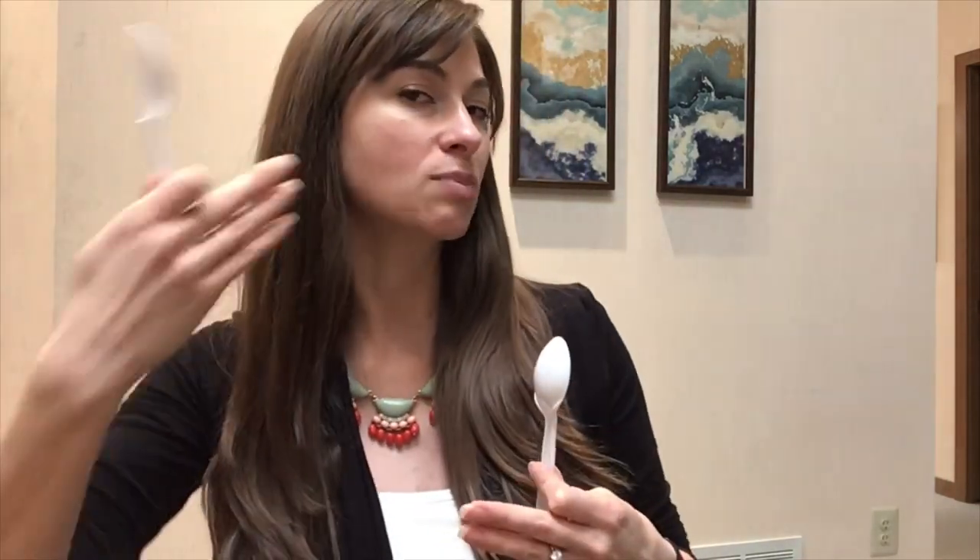Don't push your chin forward and bite on your front — bite on your back teeth when you do them. Make sure to take the picture from as straight on, as perpendicular to your teeth as possible, like this.